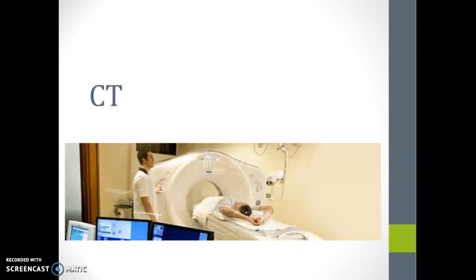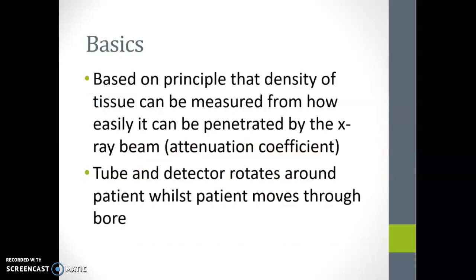Okay, so looking at CT, we're going to just go through some of the basics. Based on the principle that density of tissue can be measured based on how easily it can be penetrated by an X-ray beam, the tube and the detector rotate around the patient whilst the patient moves through the bore.